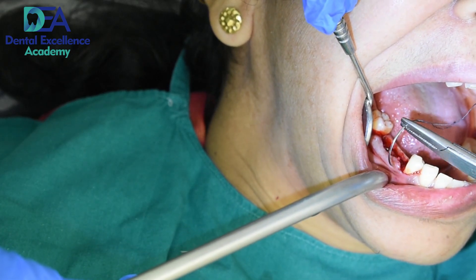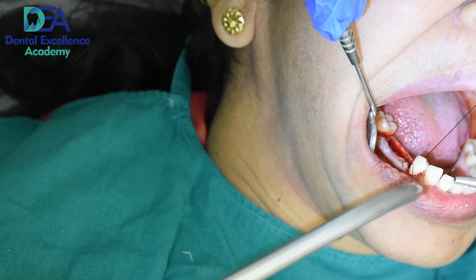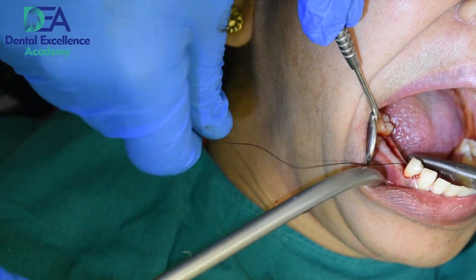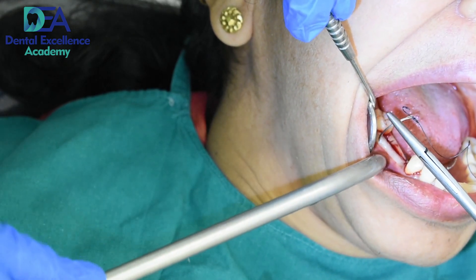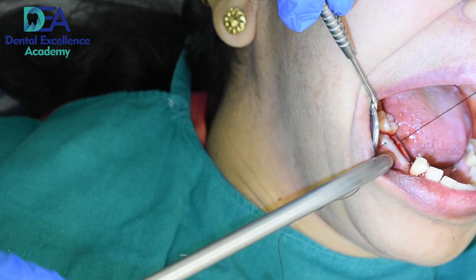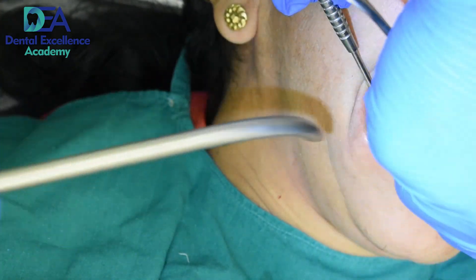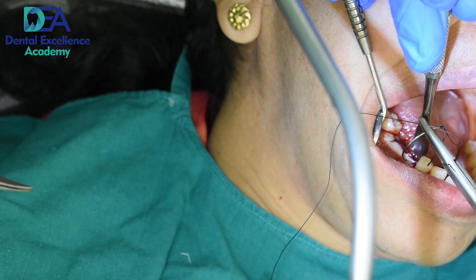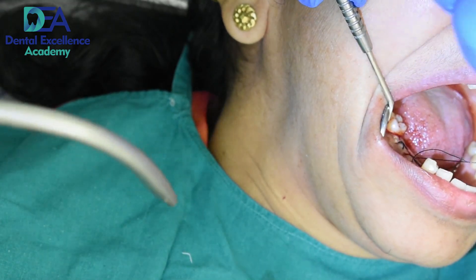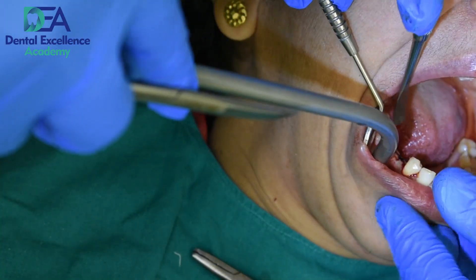Now we will be starting with the suturing. Same protocol — we have to give very tight sutures so that there should not be any flap loosening. First I am giving a single suture on both the sides, and in the middle I am going to give a figure-of-eight suture so that we can close the case properly.